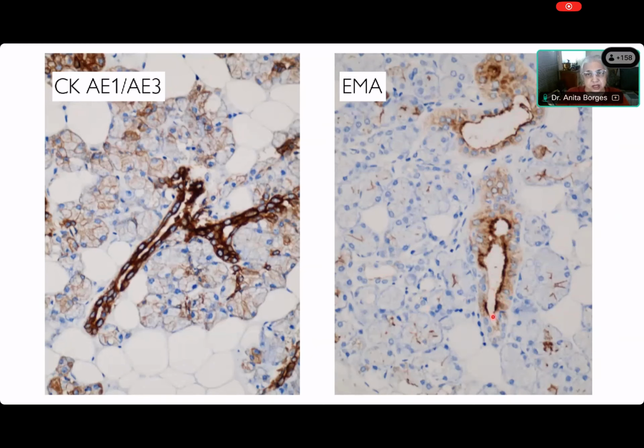Those of you who see normal salivary gland histology on a regular basis, because anybody who's doing cut-ups on cases in which the neck nodes have been dissected will see submandibular salivary gland. So please use that as a way of looking for normal histology. And in normal histology it's almost impossible to see the myoepithelial cells around the acini and around the intercalated duct.